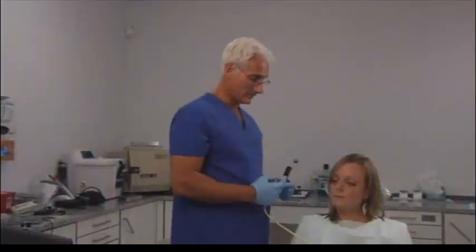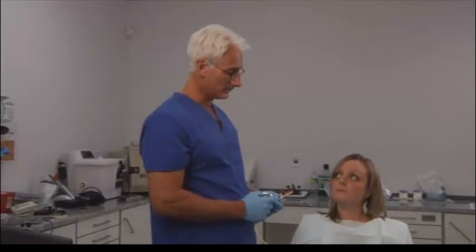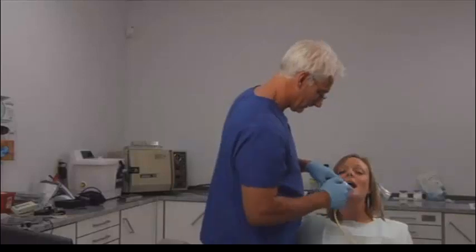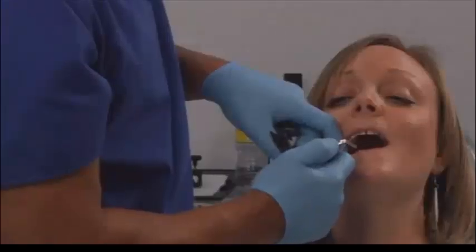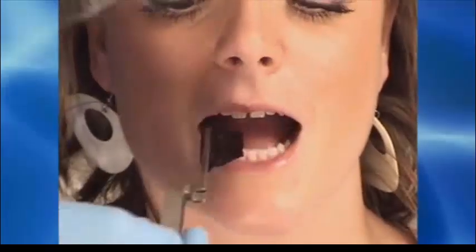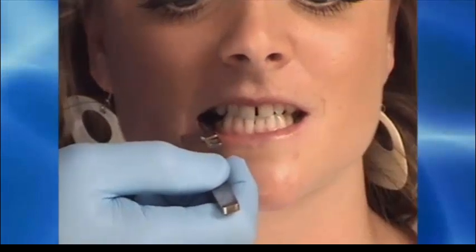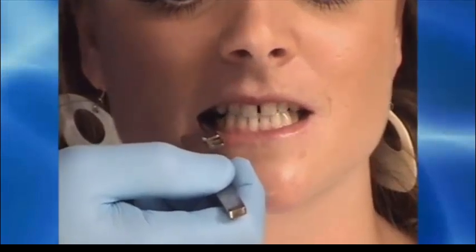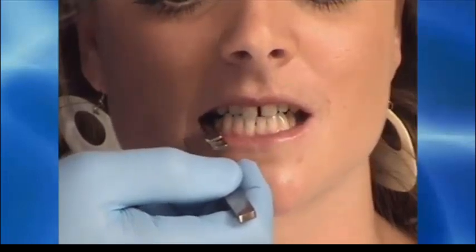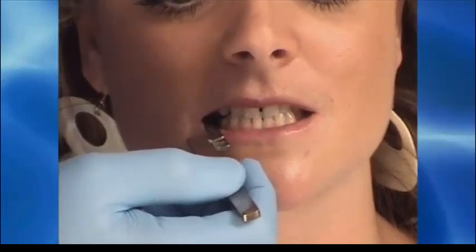So now I'm going to mark your teeth with the articulating paper so we can locate where the long disclusion contacts are present on your teeth. So put your head back for me. I'm just going to dry your teeth. Now I'm going to place the articulating paper in between your teeth. I want you to bite down for me. Slide to the right. Go further. And back. And to the left. Try to go further. Good. Now slide back to the right. Try to go further. Good. And back. And to the left. And open.